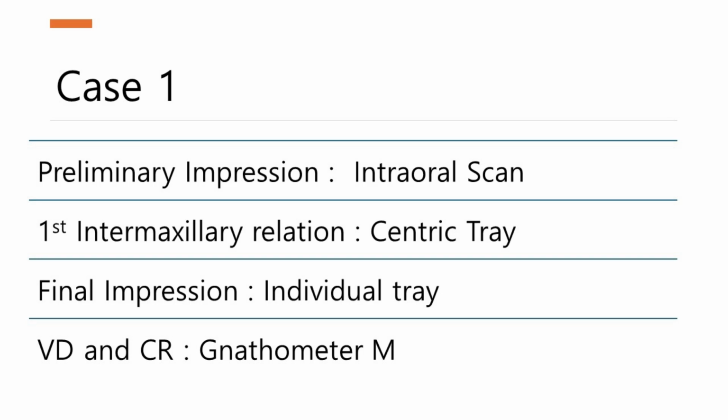Preliminary impression. We began with an intraoral scan, replacing traditional physical impression materials. The intraoral scanner provides a digital map of the oral cavity, offering a fast, accurate, and comfortable way to capture preliminary impressions directly from the patient's mouth. This method is particularly advantageous for its precision and ease of use.